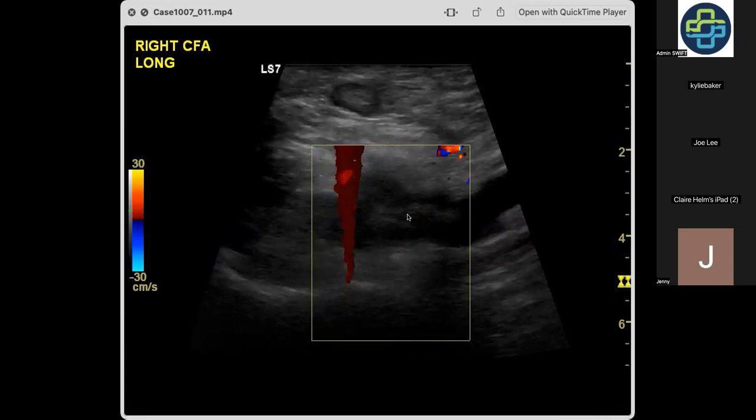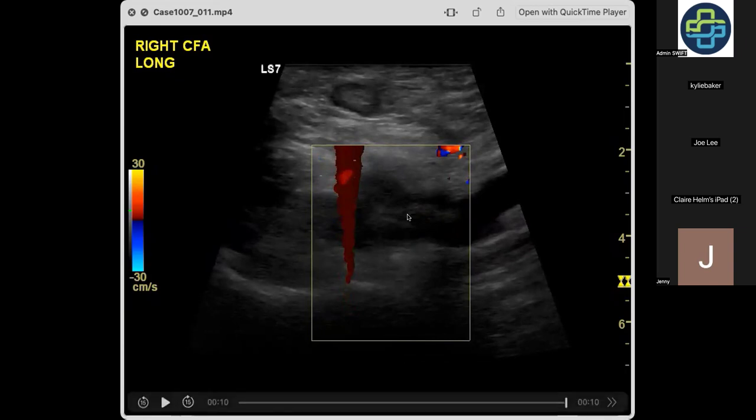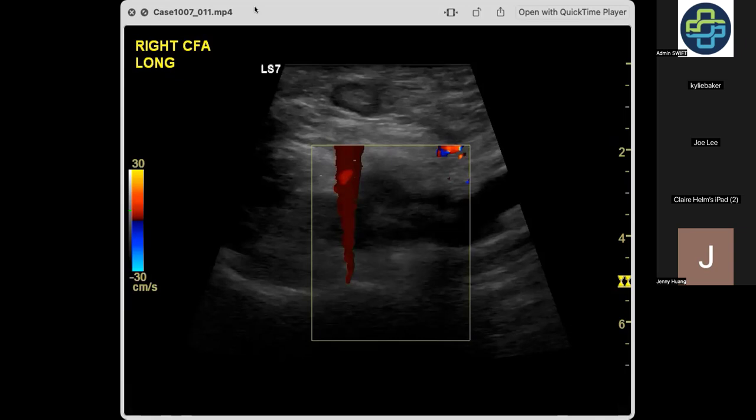What they look for is a nice straight area of a constant caliber to attach the stent to, without excluding any important branches. So that's another endoleak, and again, one of the ones big enough to see on color Doppler. And yeah, he probably shouldn't have sat at home on the weekend, but he did.